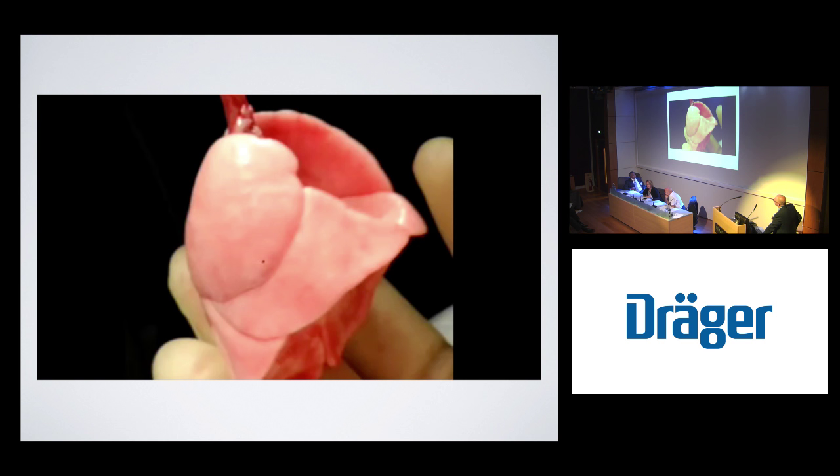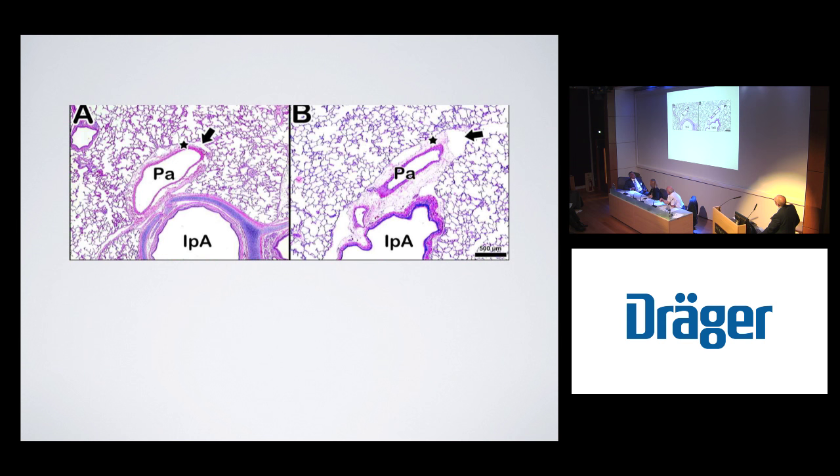Versus if we go to the next slide, we now recover this same injured lung with APRV, and you can see, as Dr. Habashi was describing, the release is very brief. And so the pressure is held for a longer period of time, as Dr. Camporota explained, the 90% versus the 10% on the release. So you recover the homogeneity. Thank you. And this is the slide you were mentioning about the lymphatics.